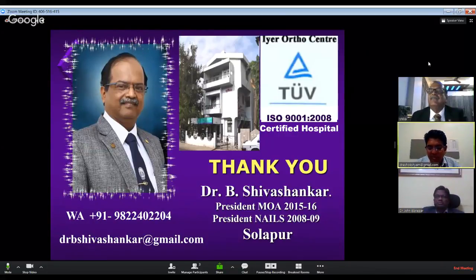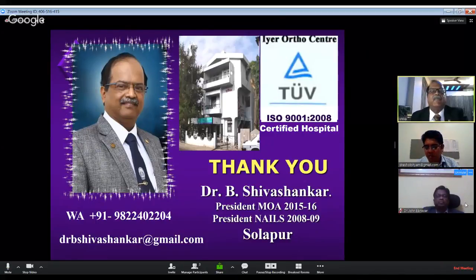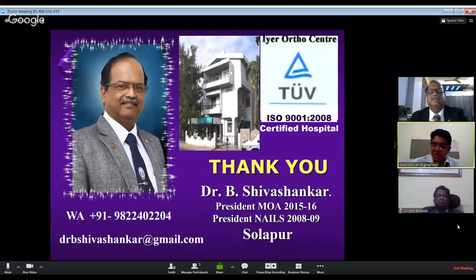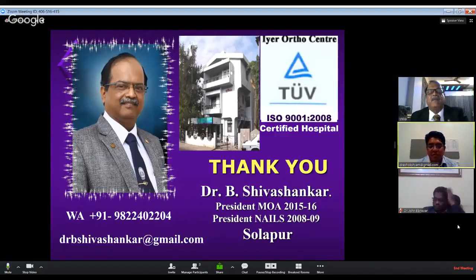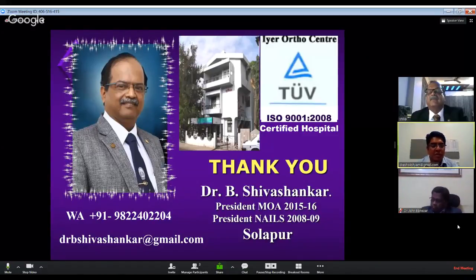So we have just two more questions for Dr. Shivashankar, then we can shift to the hip topic. Just two more minutes, sir. Yeah. Dr. Paresh Pandya has asked, sometimes when the entry point passes through the fracture site, reaming over the guide wire leads to lateralization of the shaft and a gap appears at the fracture site. What should we do in these cases?